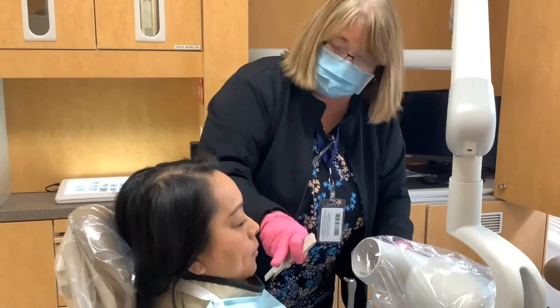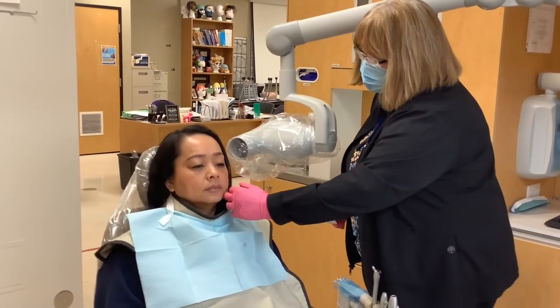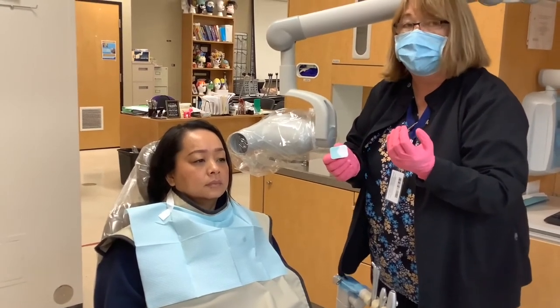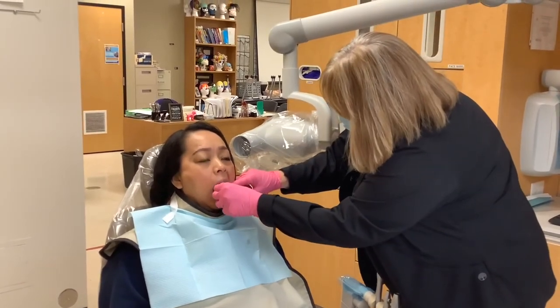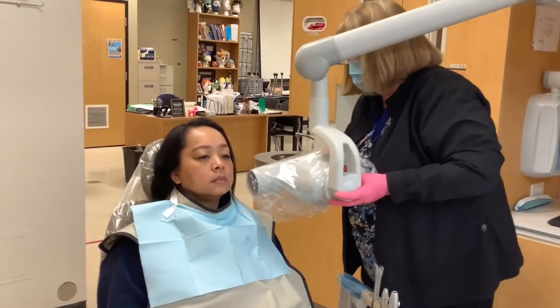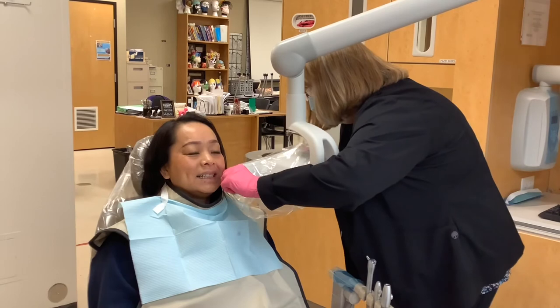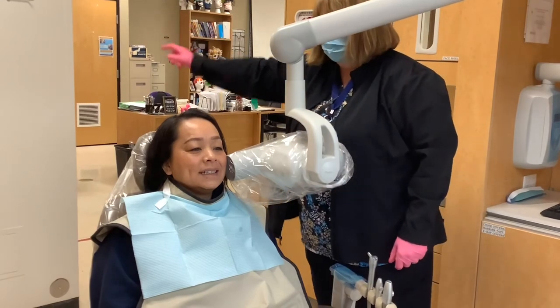Okay, repeat — going back to the other side. Now we're going to do the bite wings. Bite wings show the maxillary and mandibular in one shot — just the contact points. When doctors are working on a patient they want to see if there's decay in between the teeth, and this is how we get that shot. Place it right over the molars and bite together. On this shot it's usually between zero and five — every face is different. Let me see the end of my tab — raise it up, half on the maxillary and half on the mandibular. Hit my button, there's my shot.